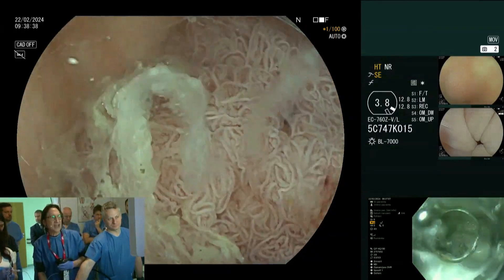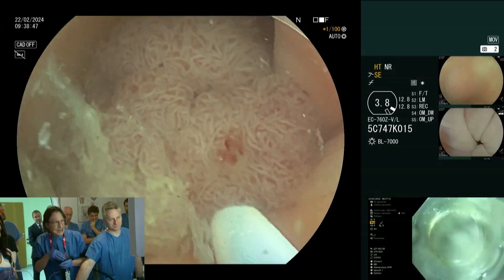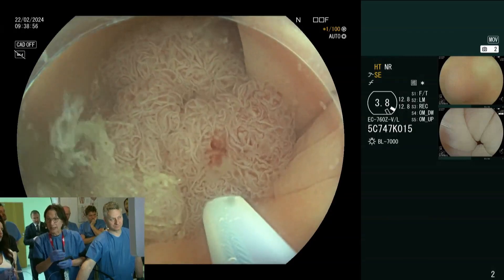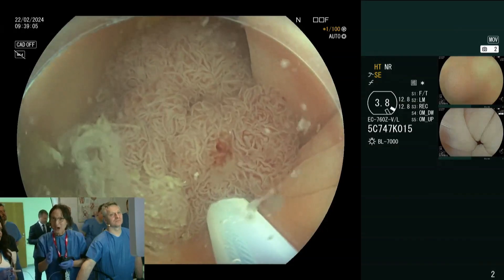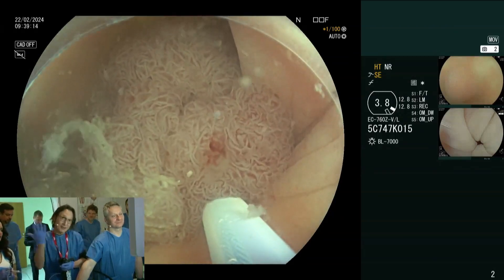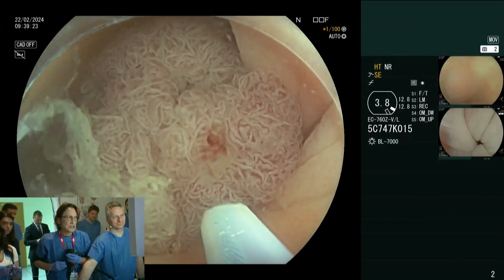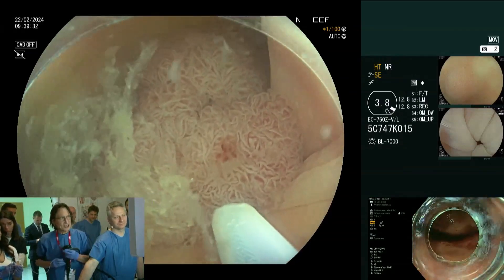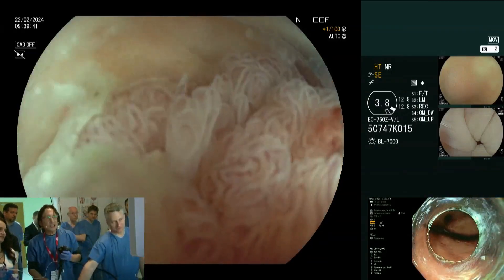As a disclaimer, this patient has pandiverticulosis — many times I thought I was in the cecum looking at the appendiceal orifice, but it was diverticula. I'm just praying there is no diverticulum at the base of this lesion. First step is forced coag — just priming it a little bit. Now I go to the cutting current, the yellow pedal, looking for some bubbles. She just holds — and it just cut through. Sometimes she's just holding it and it will cut through.